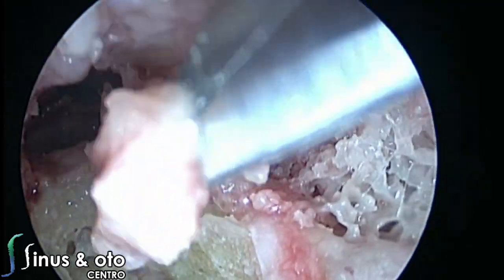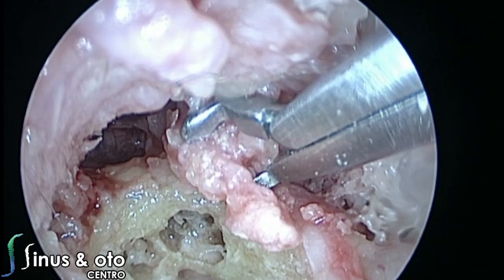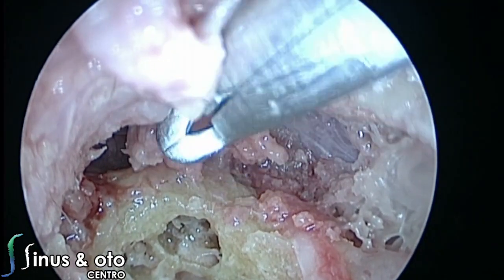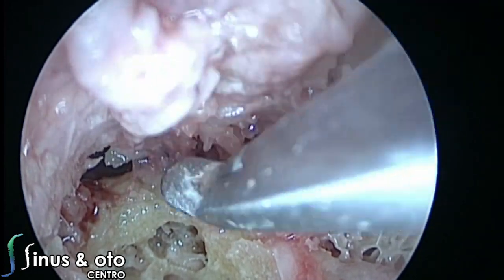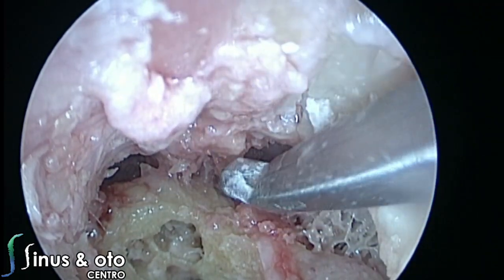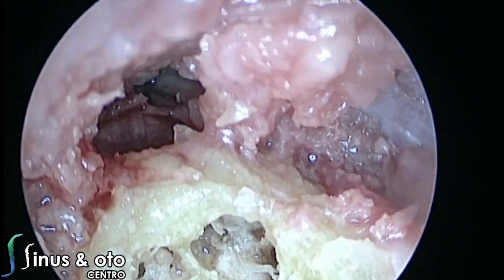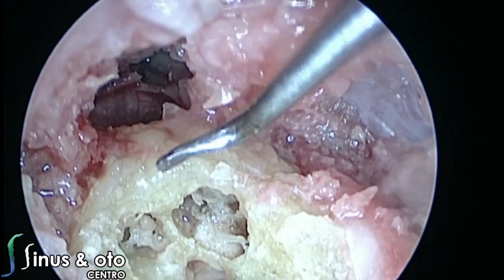We are removing a little bit of the muscle. We see the middle fossa dura, we see the facial nerve, the geniculate ganglion, we see the inner ear nerves, we see the vestibule, we see the lateral semicircular canal. We understand the anatomy, and this is very important, I think, not for you to perform surgery in this region, of course, if you don't want, but to understand the relationship between these anatomical structures in order to understand the anatomy, and in order to understand possibly the approaches that can be performed to remove diseases in this region.